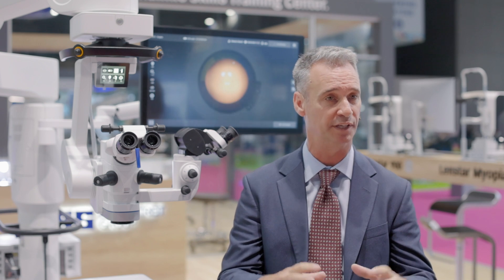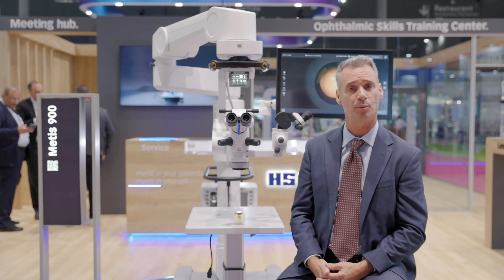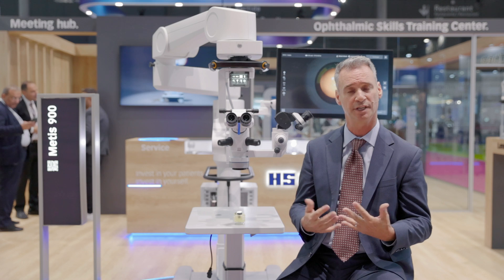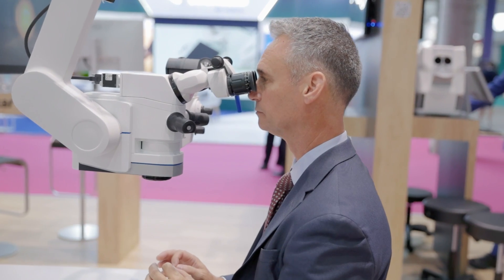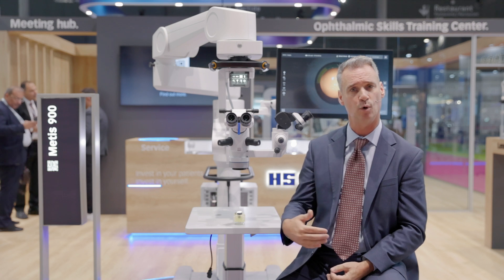Another key aspect of the Metis is the ergonomics. We designed the microscope so the surgeon can relax their head above their shoulders and not have to lean into the microscope. This provides a clear benefit — not having fatigue throughout the day, at the end of the day, or getting fatigue throughout their entire career.